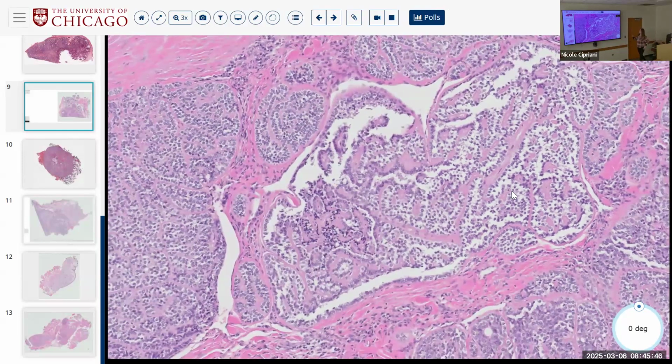In cytoplasmic clearing, think about something that is either a pure myoepithelial cell carcinoma, an epithelial myoepithelial carcinoma, or for that matter, one of the hyalinizing clear cell carcinomas. You can knock out hyalinizing clear cell carcinoma because of the ducts, and you can knock out myoepithelial carcinoma because of the ducts, right? So you're mostly left with this one based on morphology.